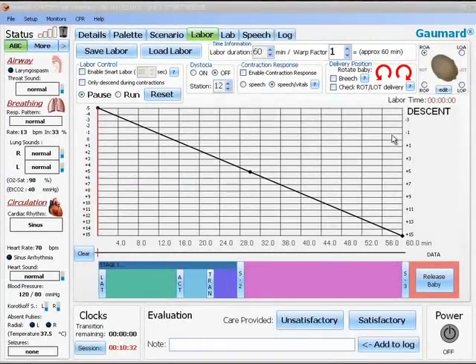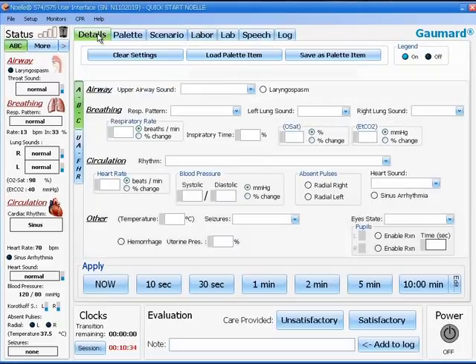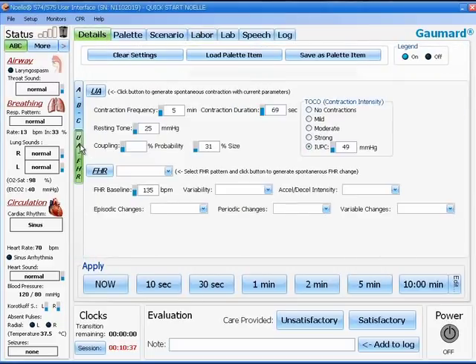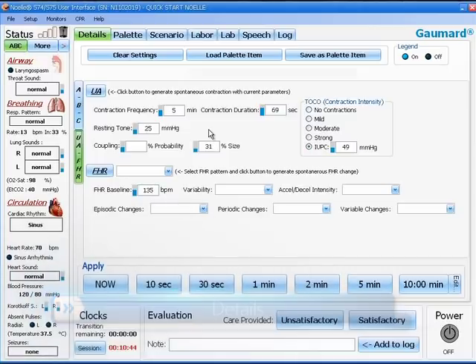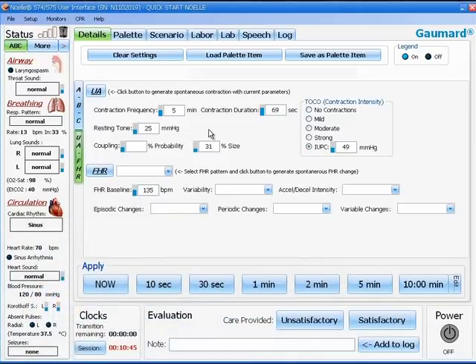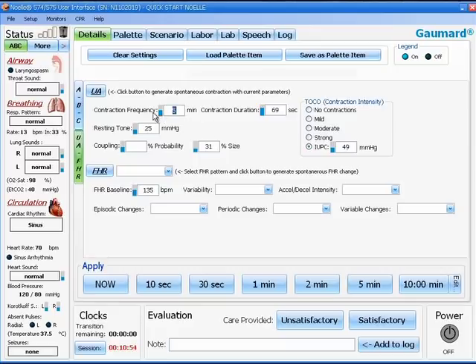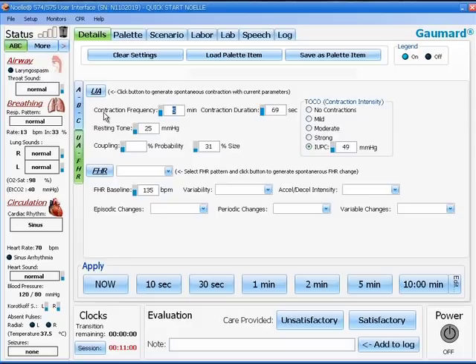A feature of the software that is unique to NOEL is the uterine activity and fetal heart rate controls on the details page. First, we click on the details tab of the software and then we click on the UA/FHR page. This brings up the window where you can control the uterine activity and the fetal heart rate.